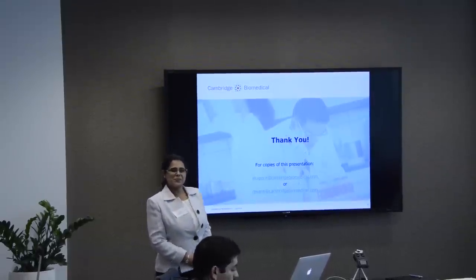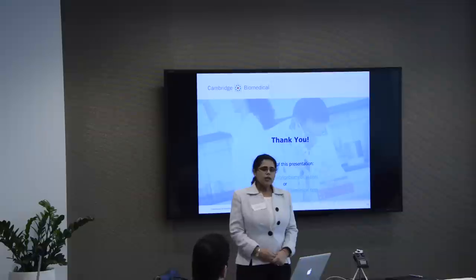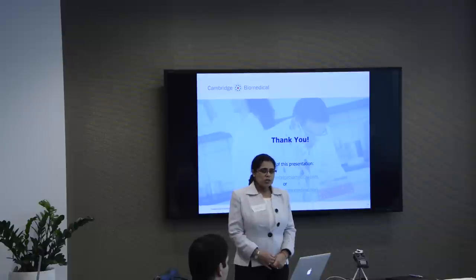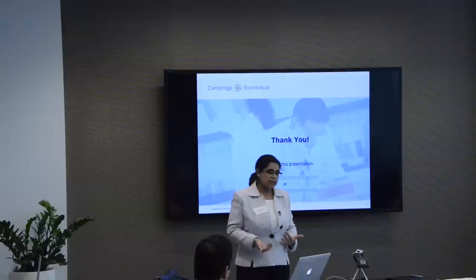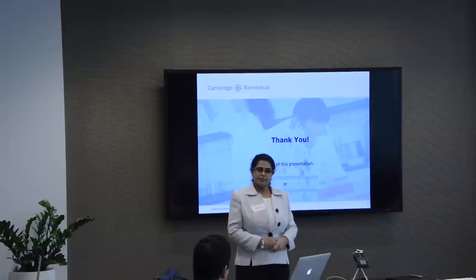Do you see the matrix issue when you use the Luminex for your tests? How do you solve the problem? Generally, the matrix effect is there sometimes, sometimes not. When we look for the matrix effect, we do spike and recovery to see whether it is accurate or not. If we don't get accuracy, there is a matrix effect. Usually, as you said, when you dilute samples, you can overcome this problem. So what dilution do you usually use for the Luminex?